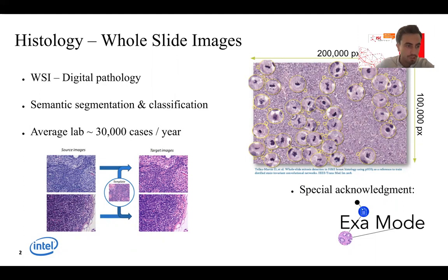Our task in this research was the semantic segmentation of cancer tissue, and thereby also the classification at slide level of the amount of metastasis present in the tissue. In this research, we focused on data from the CAMELYON challenge, which are whole slide images from the dataset of Radboud University in Nijmegen, Netherlands, which are common in research on computer-aided diagnosis of tumor tissue.